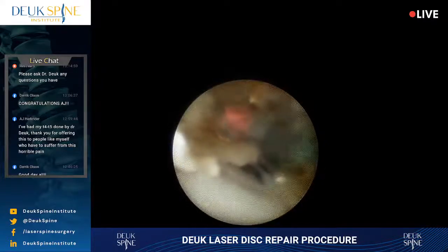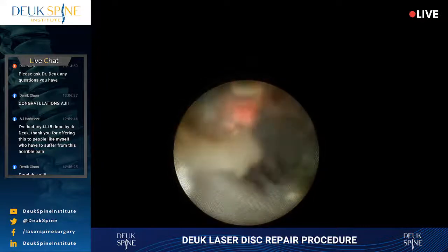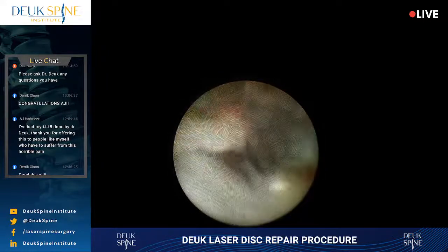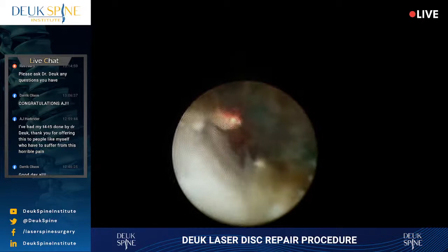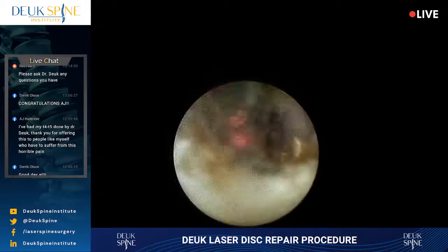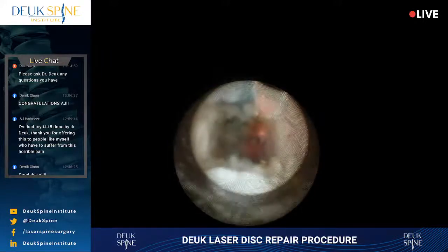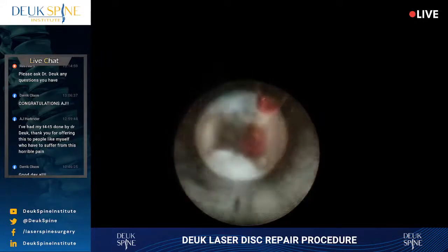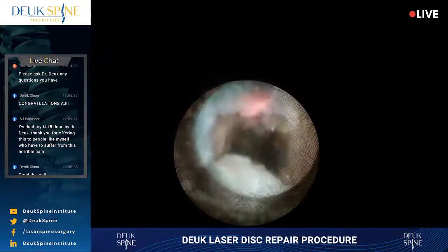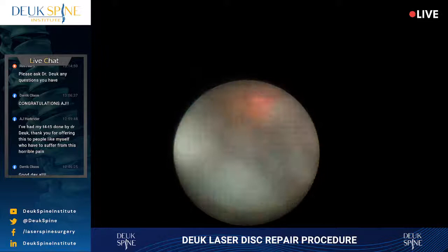All right, he's awake. I think he may be, but we are getting to the more painful area, so I would just keep an eye on it. We're almost done, but we need about 5 minutes left. You can see how big the tear is, by the way. Huge tear. The blue line tells you where the tear is. I just need 5 more minutes, but this is going to be the more painful part of the tear for him.